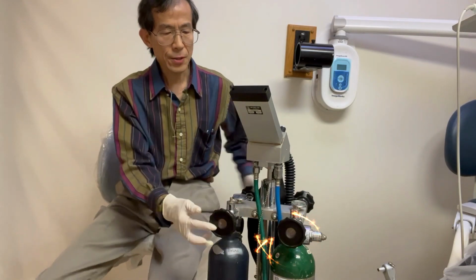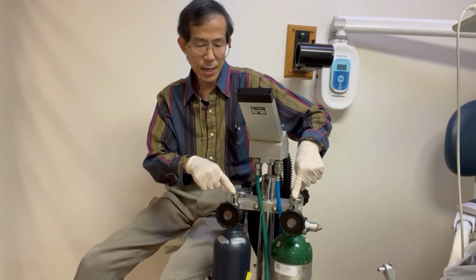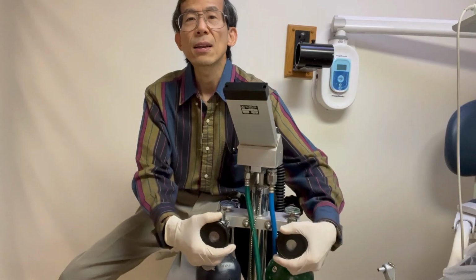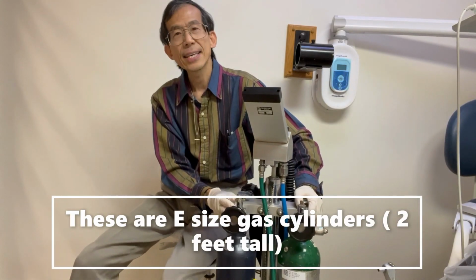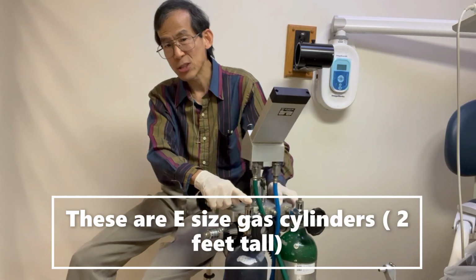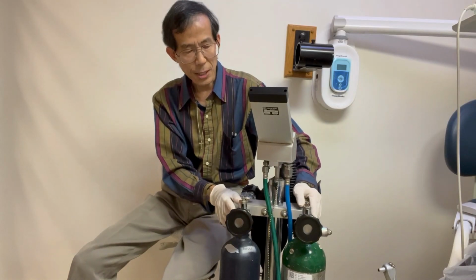You have a couple of knobs here where your oxygen tank, the green colored one, and the nitrous oxide tank, dark blue, are mounted into this unit. There are pins here that tighten up and lock the cylinder. This is an E-size cylinder, about 2 feet long. Including the top part, it will be 29 inches tall. These pins are for mounting the cylinder onto the mobile unit.